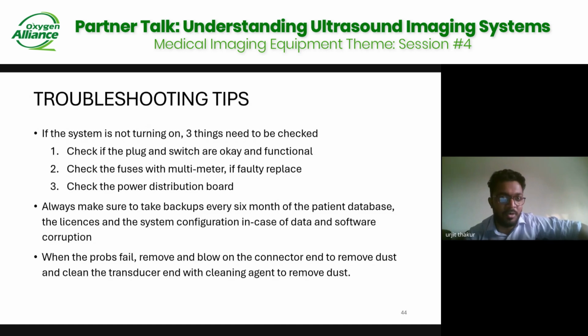Also, this is less troubleshooting and more of an advice thing: on every system, I always take backups every 6 months of the patient database, the licenses, and the system configuration. What happens is, if tomorrow by chance the software gets corrupted within the system and the customer wants the data back, but because there is no backup, the data is not there. Those customers we generally advise to take backups, but they generally don't. So it would be advisable that you take this backup, so in case he ever needs it, you have it in spare.